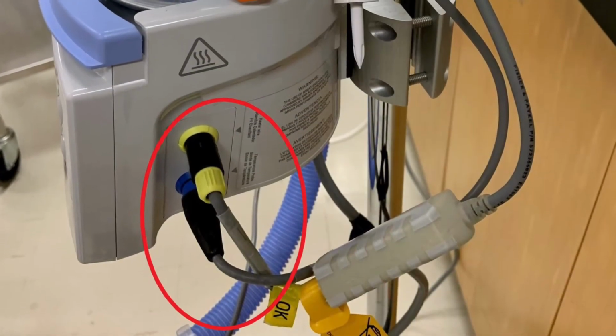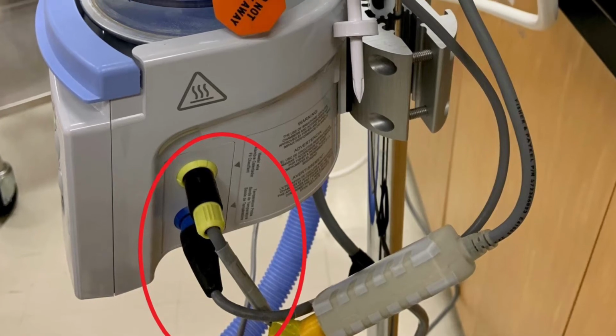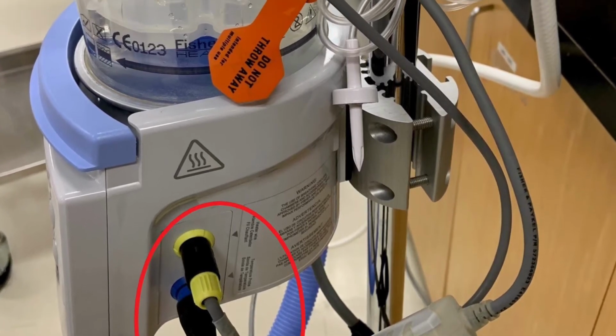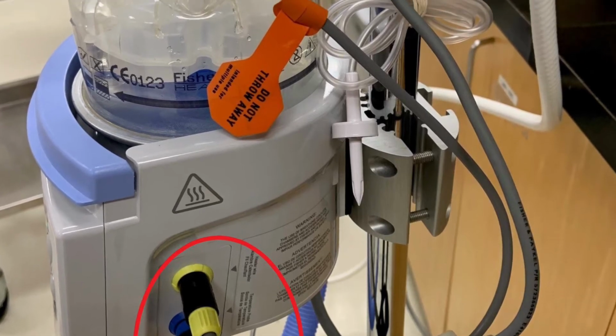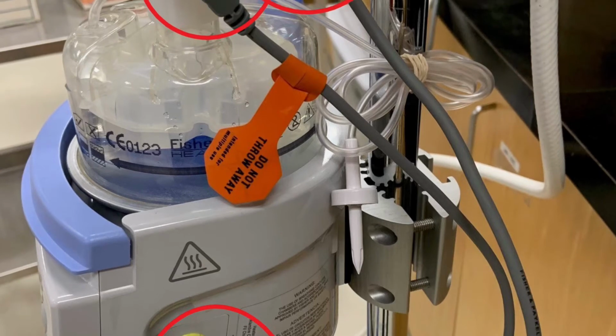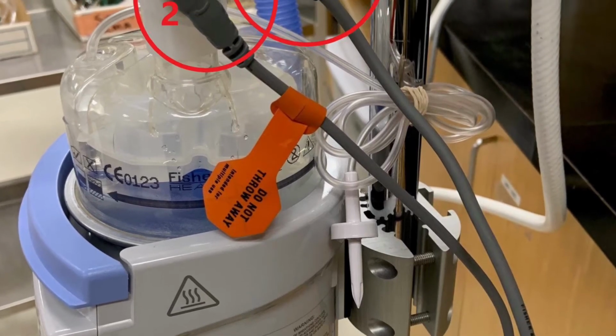There are two wires on the right side of the humidifier. One of the wires will power the heated wire in the circuit, and the other wire will be used to record the temperatures both leaving the humidifier and at the patient end of the humidification circuit.